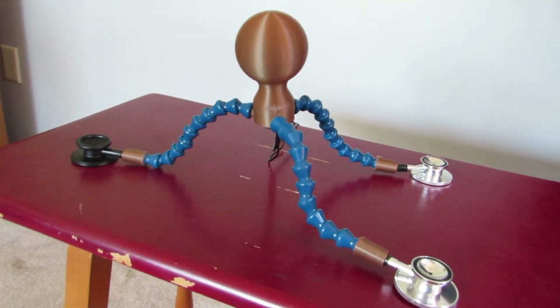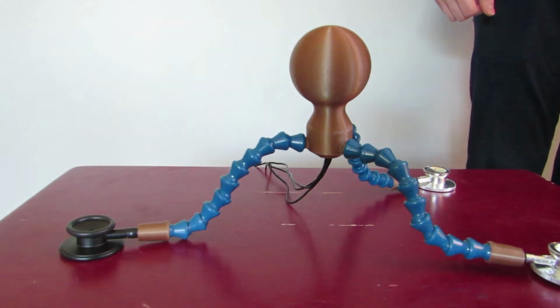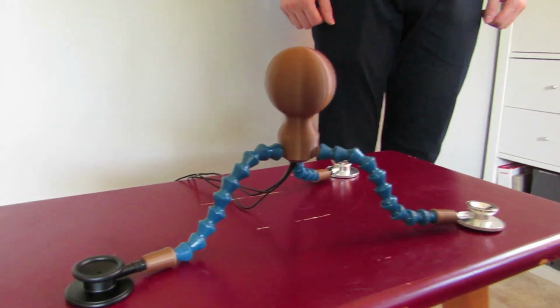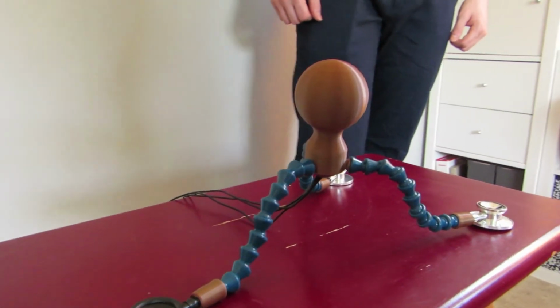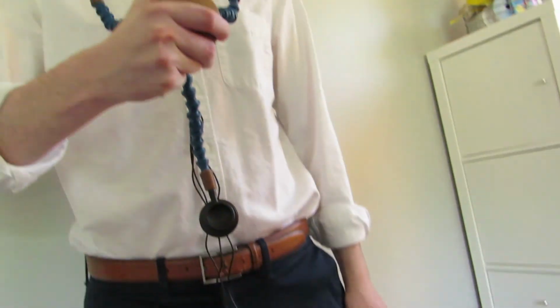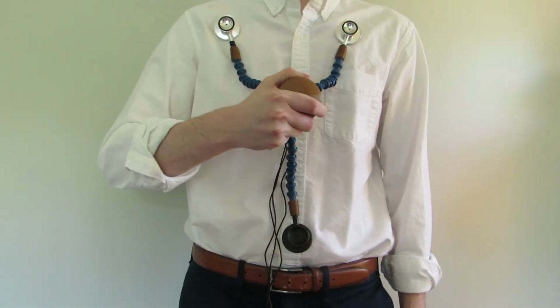Here's the sTETH-X. The primary design consists of 3 digital stethoscopes, each one attached to its own adjustable arm, allowing for rapid adjustments in emergency situations. This prototype has been designed to fit an adult for initial testing and proof of concept. Here's how it would fit on a patient. Now, let's see what readings we are getting.